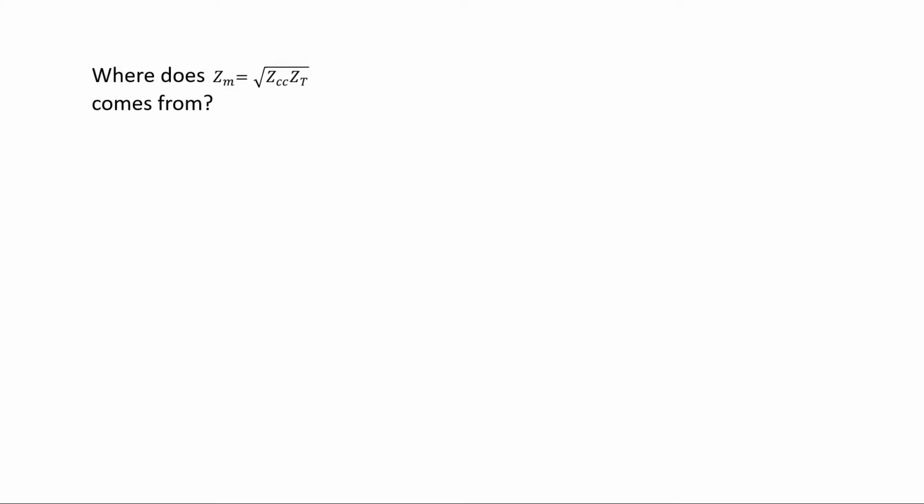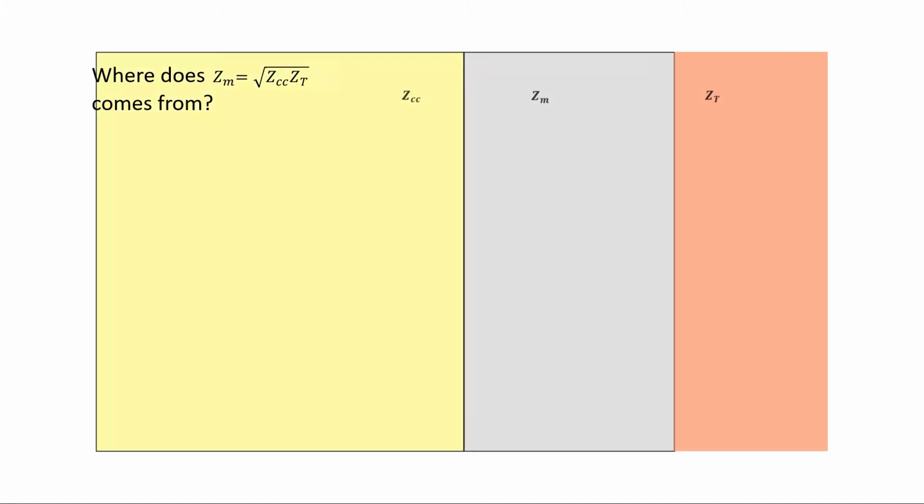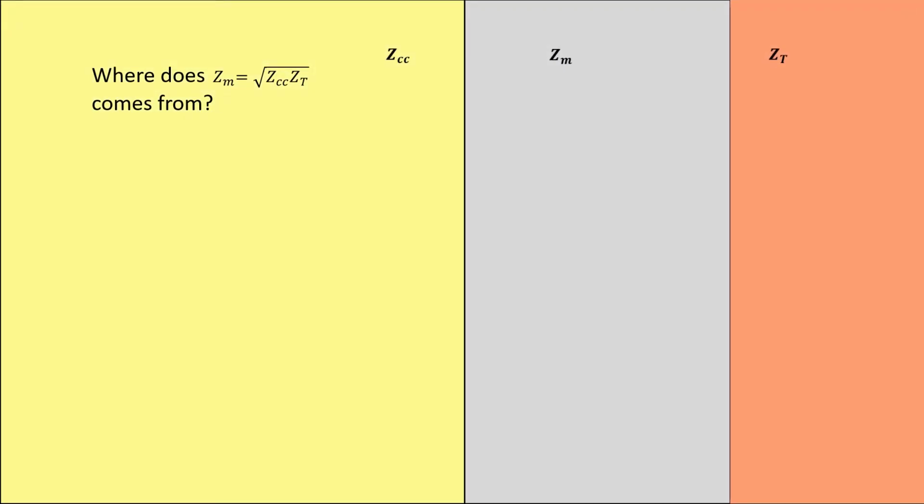So the question is where this expression comes from, right? Okay, let's go again over those waves. We're going to need a coordinate reference. Here it is. And here's the steady state exponential expression of the transmitted pressure wave.